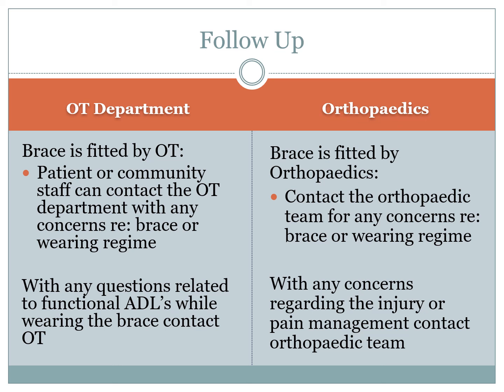If the person is in a brace fitted by the orthopedic team for 24/7 wear, then the orthopedic team must be contacted with any issues with the brace. Also, if there are any concerns regarding the injury or a person's pain management, then the orthopedic team should be contacted. As mentioned earlier, we would aim to have the treating consultant's name noted on the orthotic sheet or booklet so the patient can access the relevant secretary directly via the main hospital line.